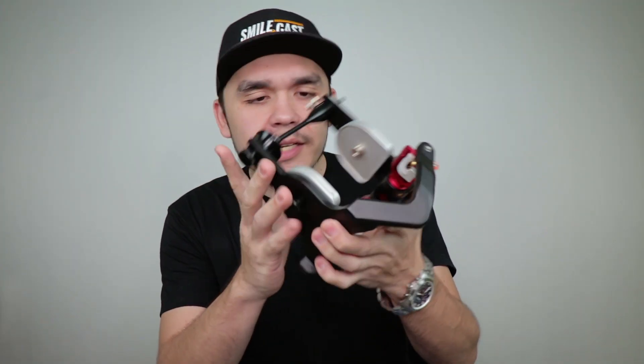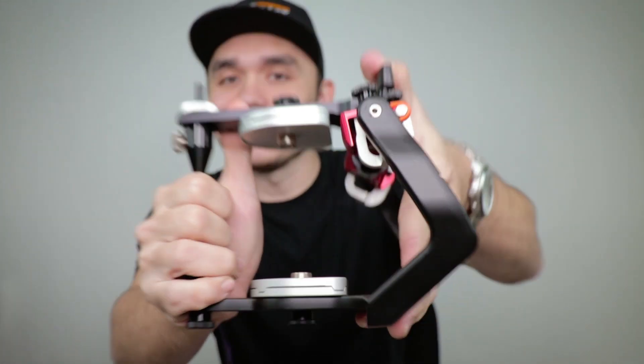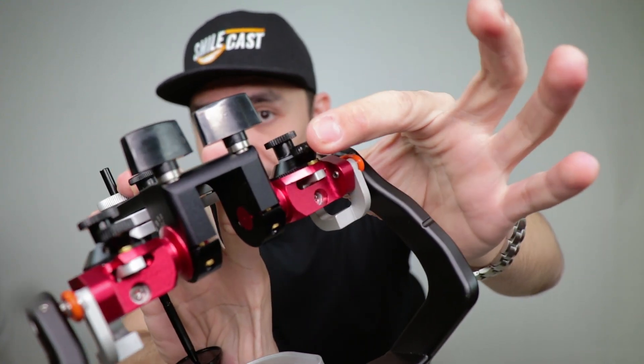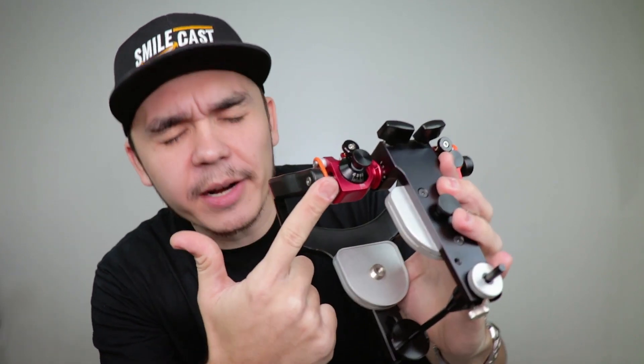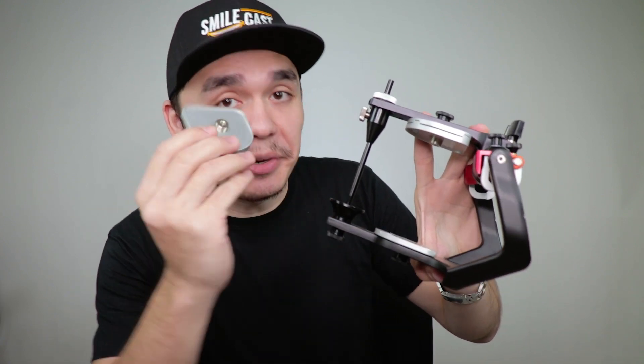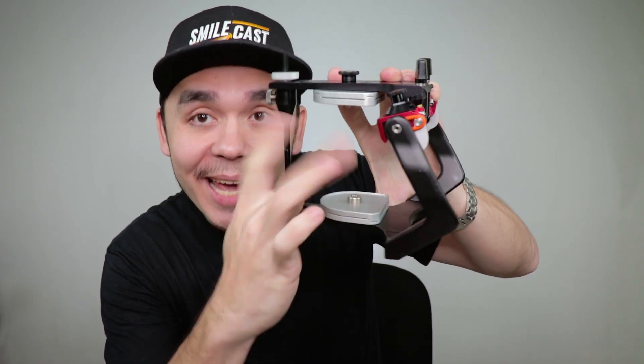Moving on to the articulator itself. This is the money — this is the big thing, the device that does it all. These are the adjustment knobs. This is your Bennett adjusters, your side shift knobs at the back, and this very noticeable guide box in that beautiful red finish. It's just gorgeous. Love it. Besides that, you have your incisal pin, the holder, the table and your mounting plates that are magnetic, of course.